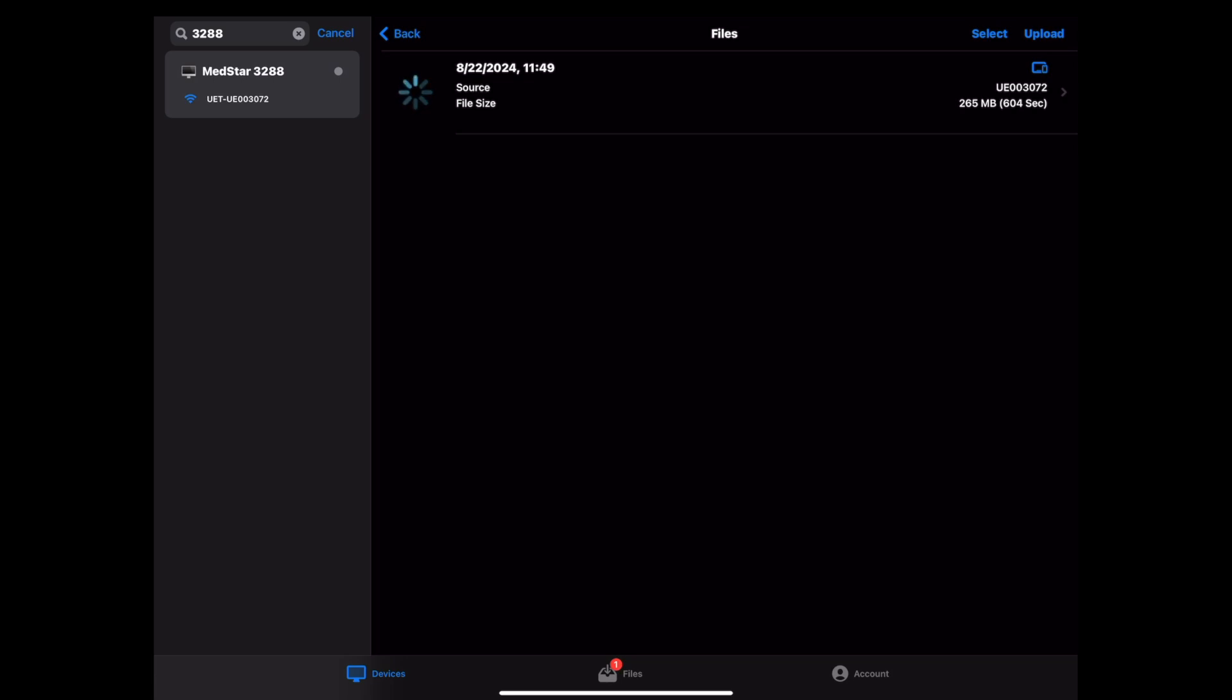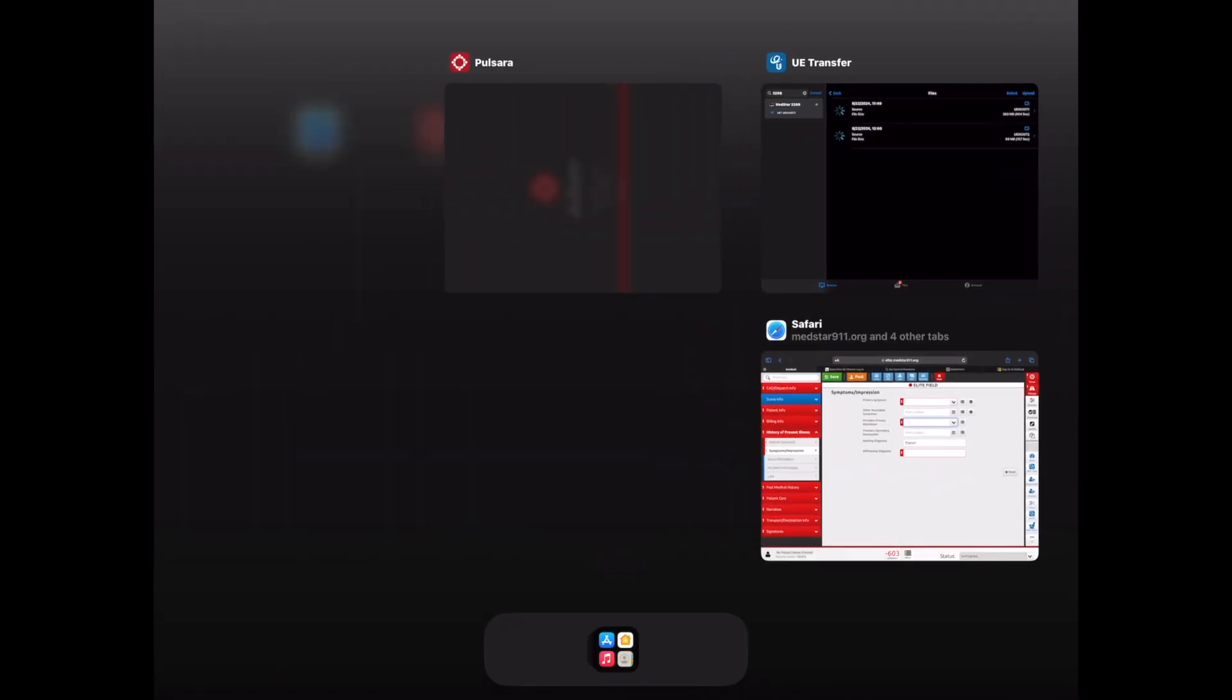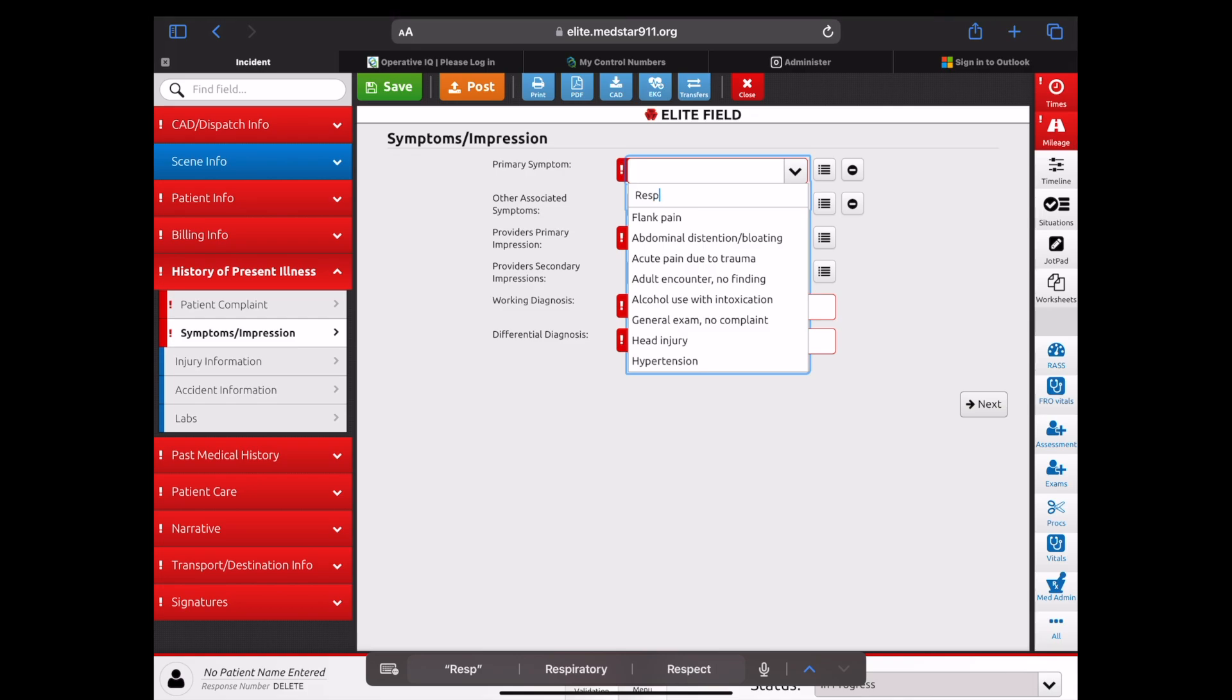Unfortunately, we are dealing with big files and often limited bandwidth on our mobile Wi-Fi. While you are waiting for the videos to upload to the cloud, you may navigate away from the app to perform other tasks such as image trend charting. The files will continue to upload in the background. Just don't force quit the app by minimizing the app and swiping upwards on the iPad.